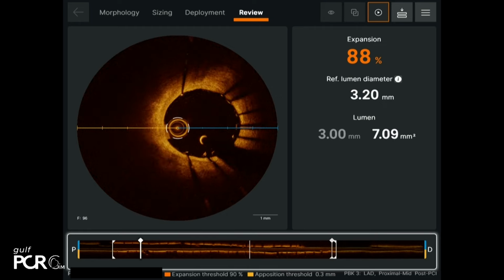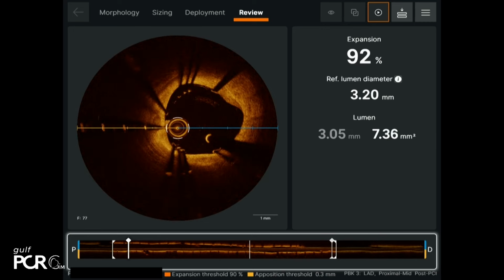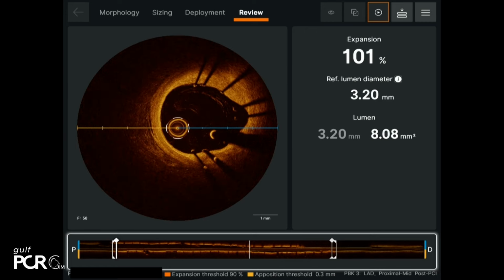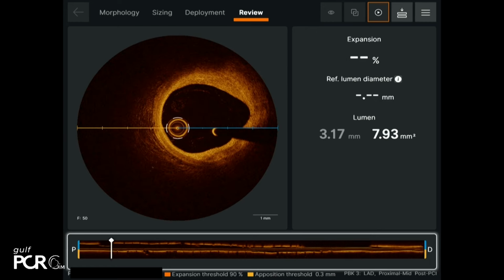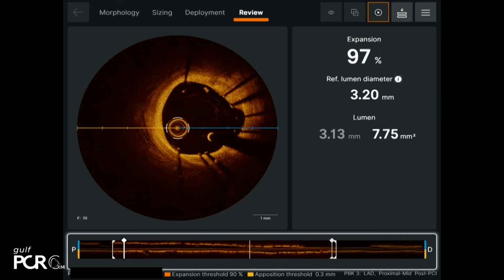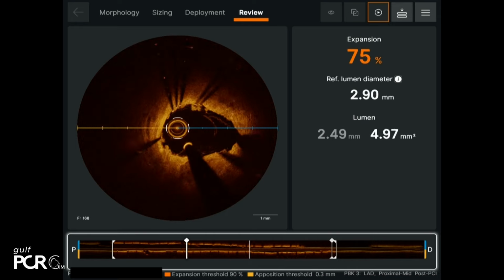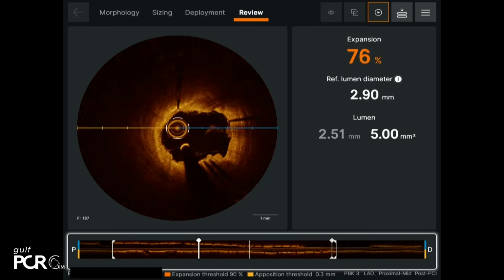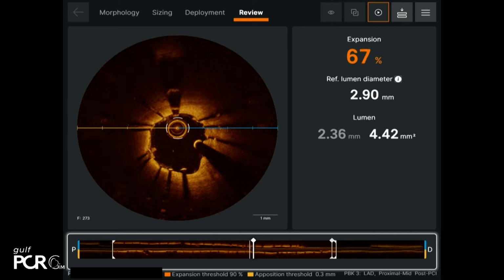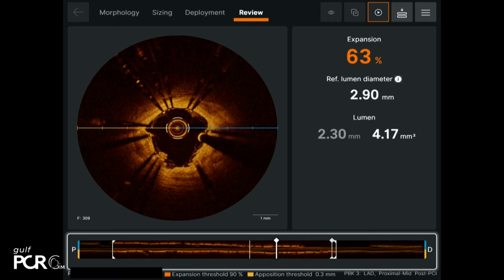3.25 NC. There is no edge dissection proximally. We believe that we can open the stent more. We'll go with a bigger balloon: distally with a 3.0 NC balloon and proximally with 3.25. But the nodule has been dealt with, to be frank with you. It's just the other segment of the vessel distal to it.